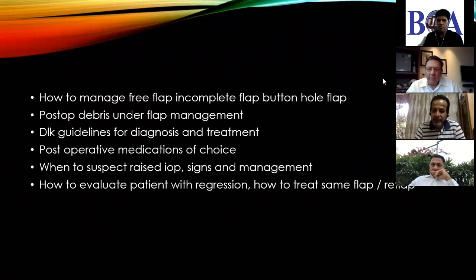I think this has covered it. Baja, anything to add? No, absolutely. When you measure the pressure, it will invariably be low, because you're measuring the fluid pressure in the interface.